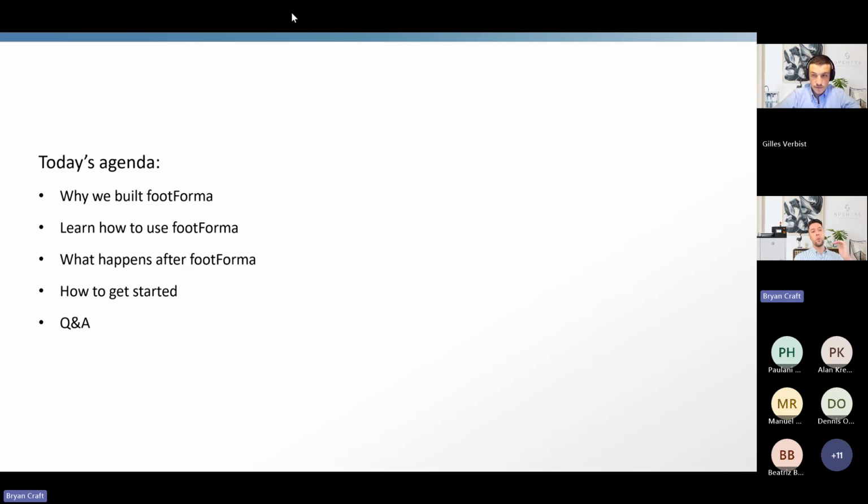We're going to start with the why. Then you're going to learn exactly how to use it with Gilles opening up the application and going through a live demonstration. What happens after you modify that mold? We'll talk about it. How to get started and Q&A.